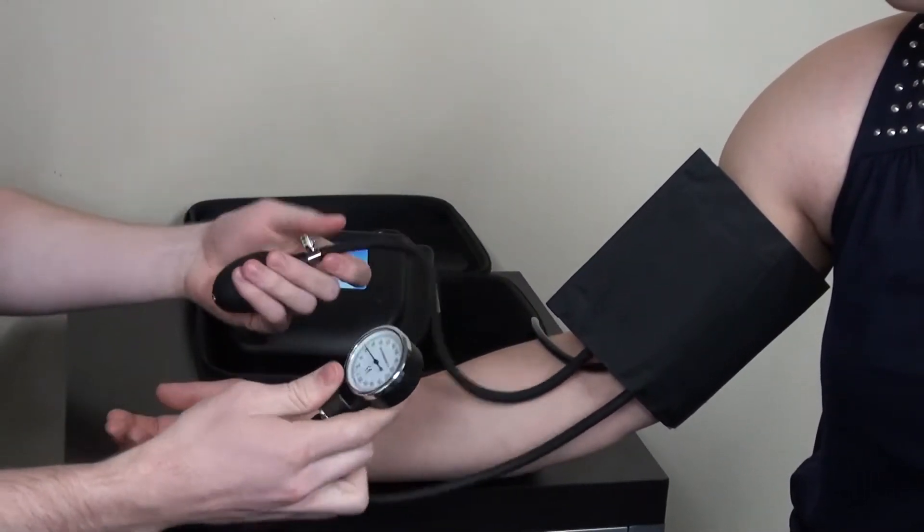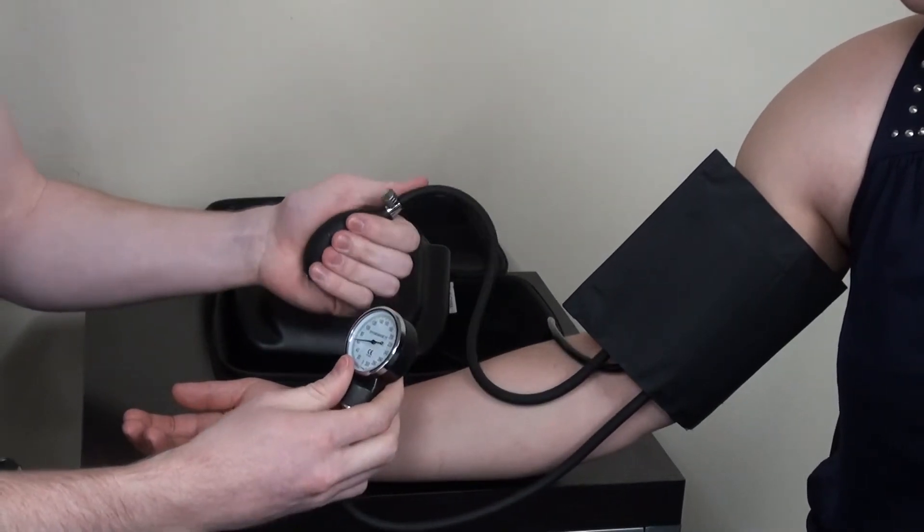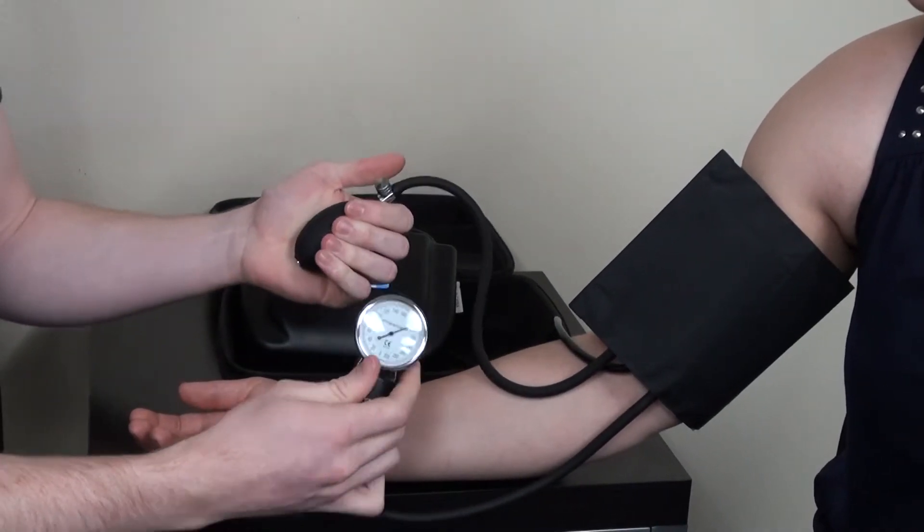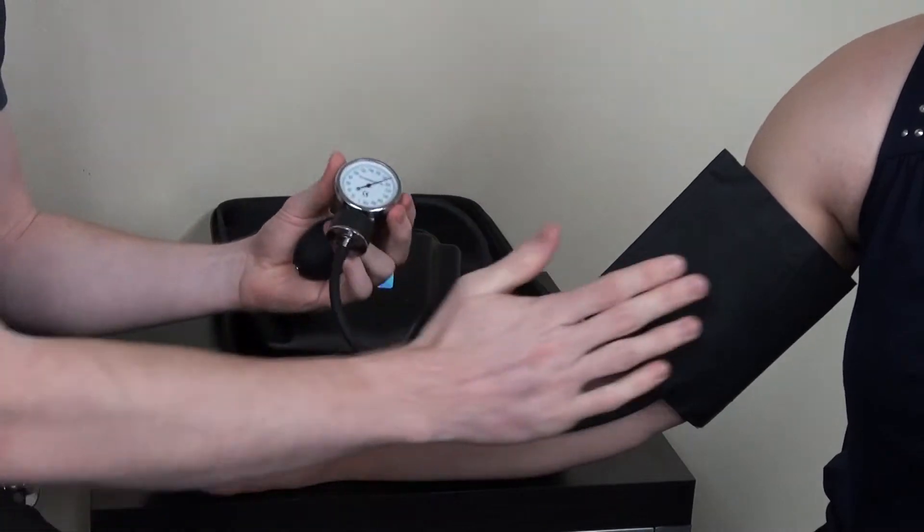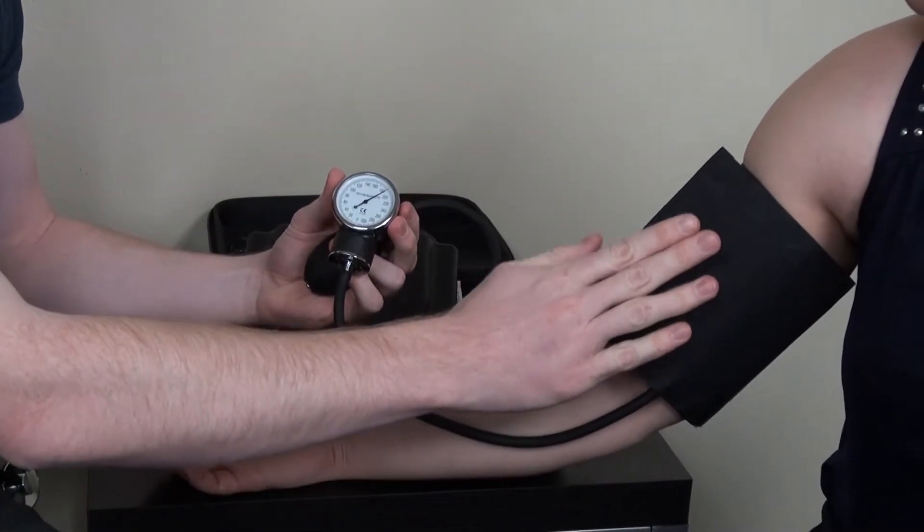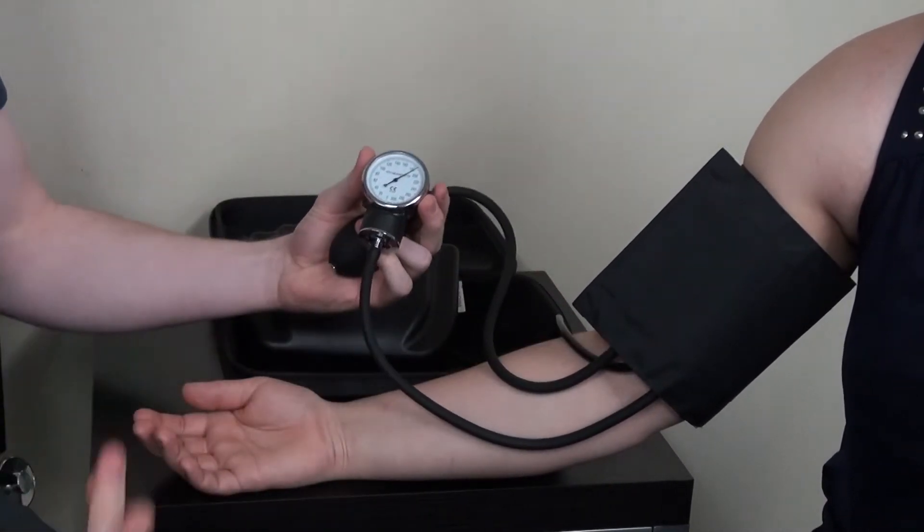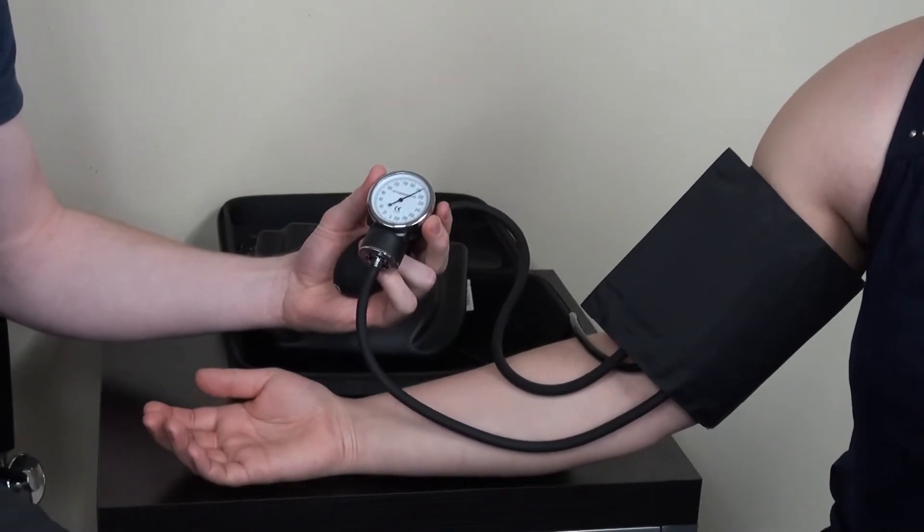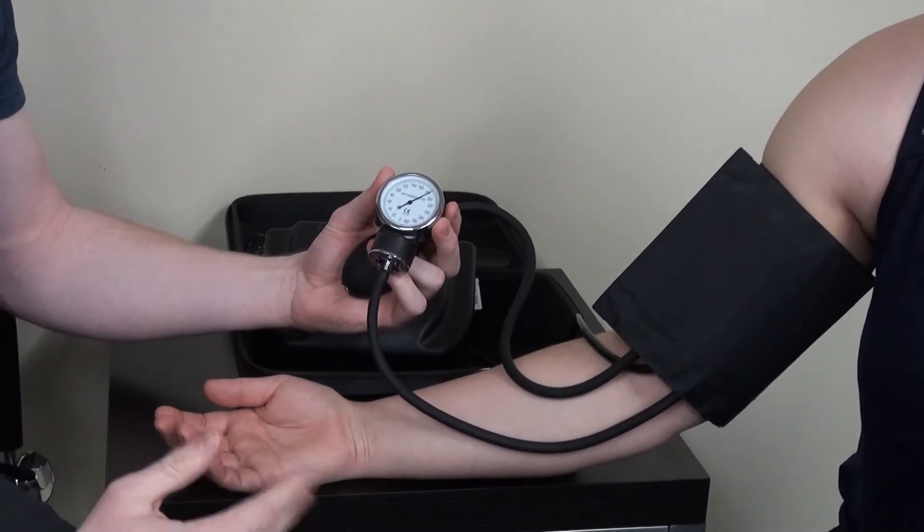Once again we have our analog dial and pressure bulb to pump up the cuff, although the cuff does not actually inflate so that a student can wear this for a full class period and not have to worry about circulation.